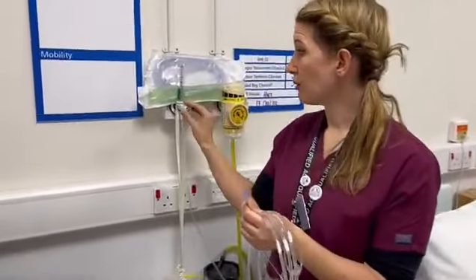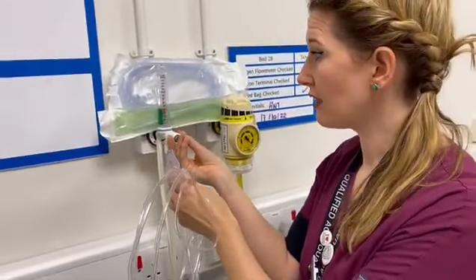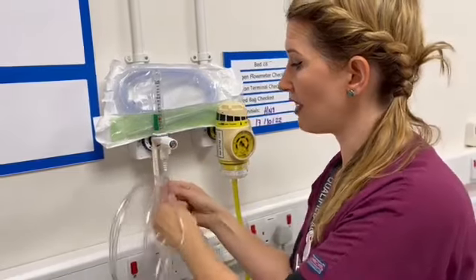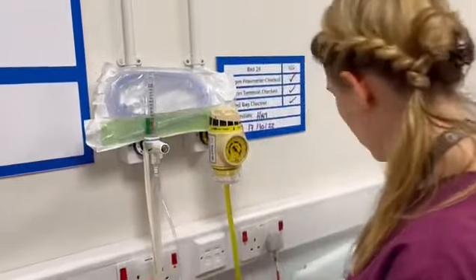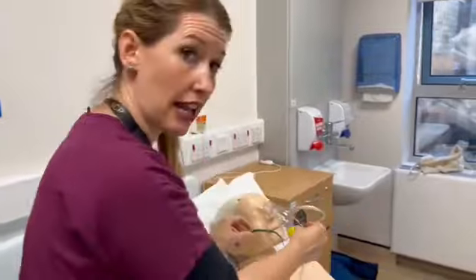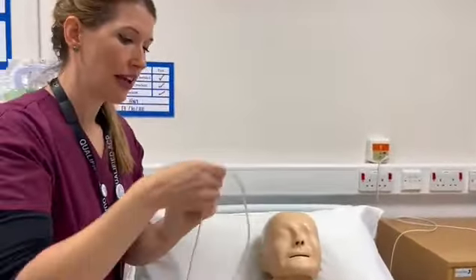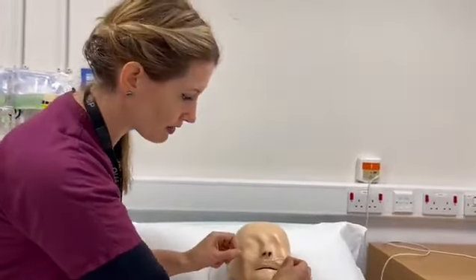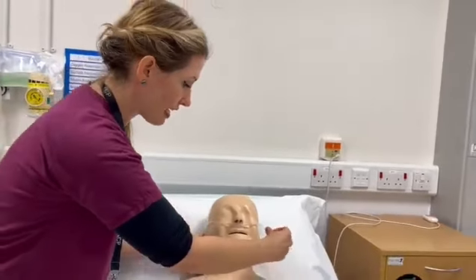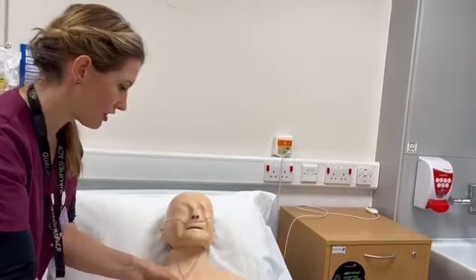And what I will do is I'll come to my flow rate here. I will reduce that down to 4 litres, and I will then remove this and switch and push hard on with the nasal cannula. I will then come to my patient, explain to them that I'm going to change over the nasal cannula, remove the mask, and the way this works is you will see that it curls up into the nostrils. So I tend to hook it up into the nostrils, hook behind the ears, there we go, and then just tighten it under the chin.